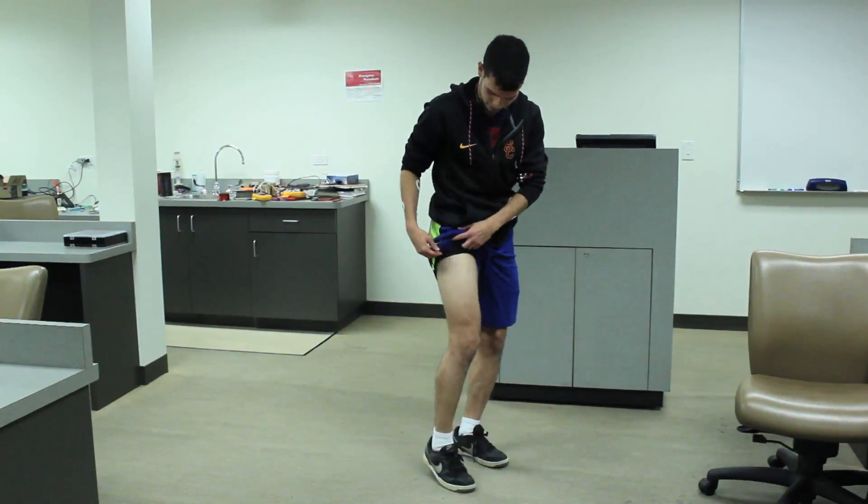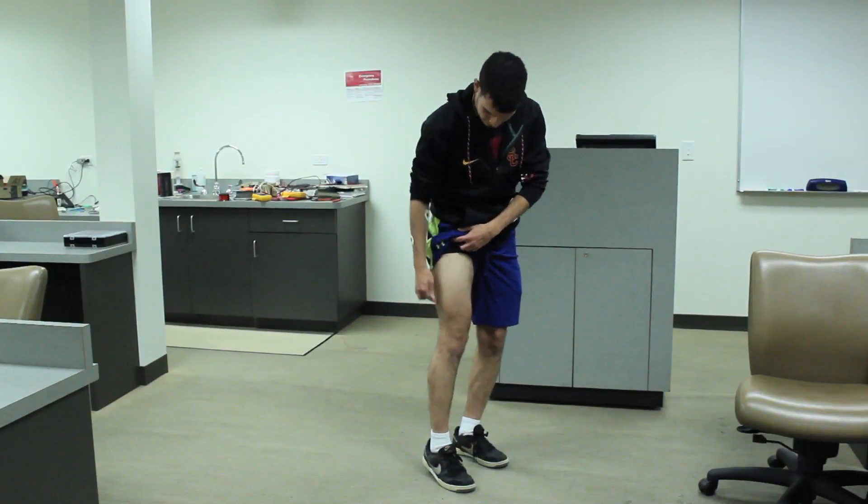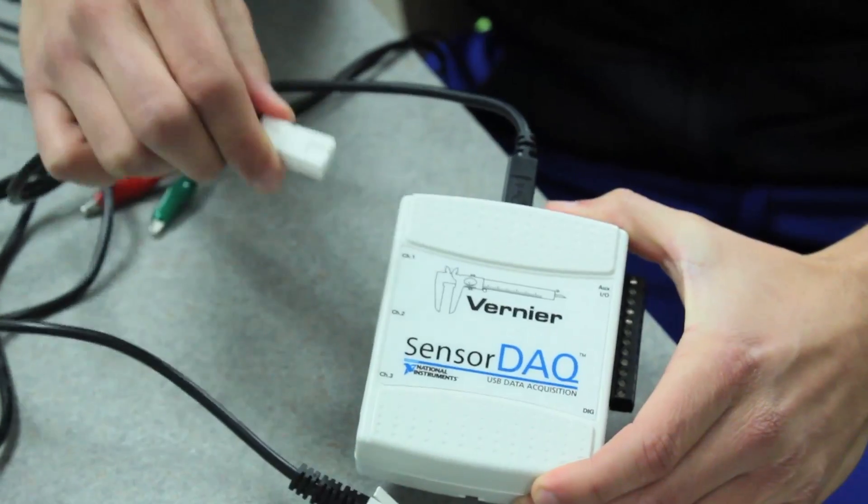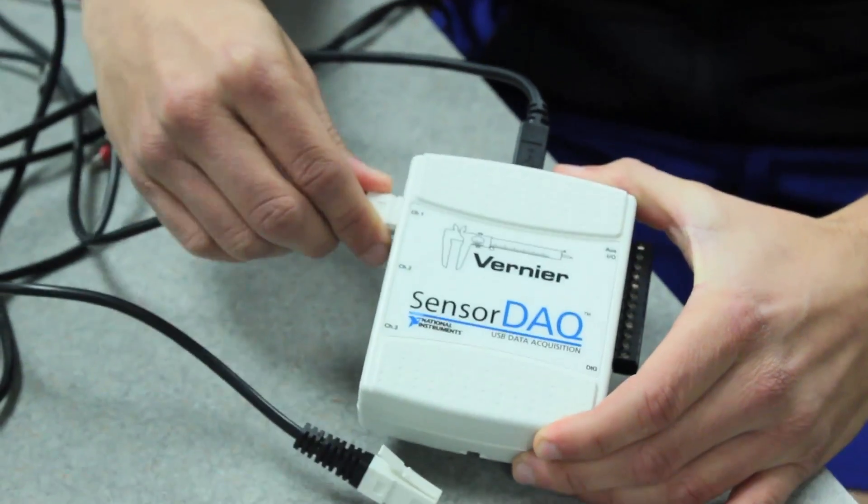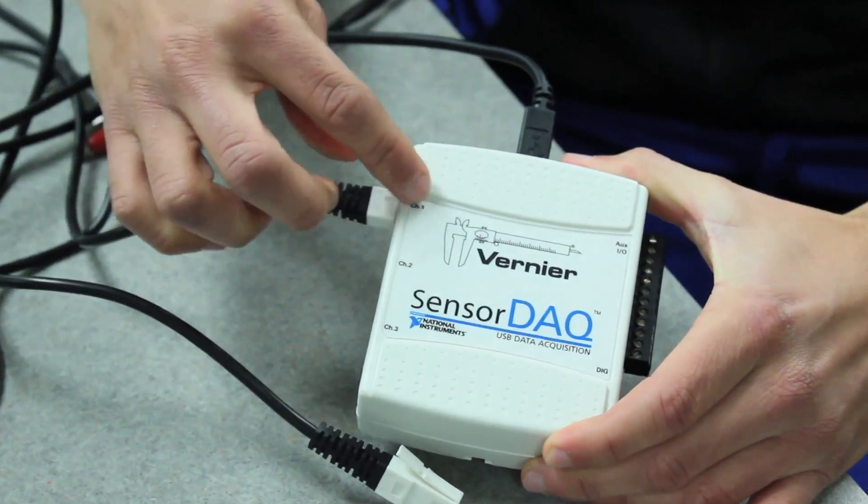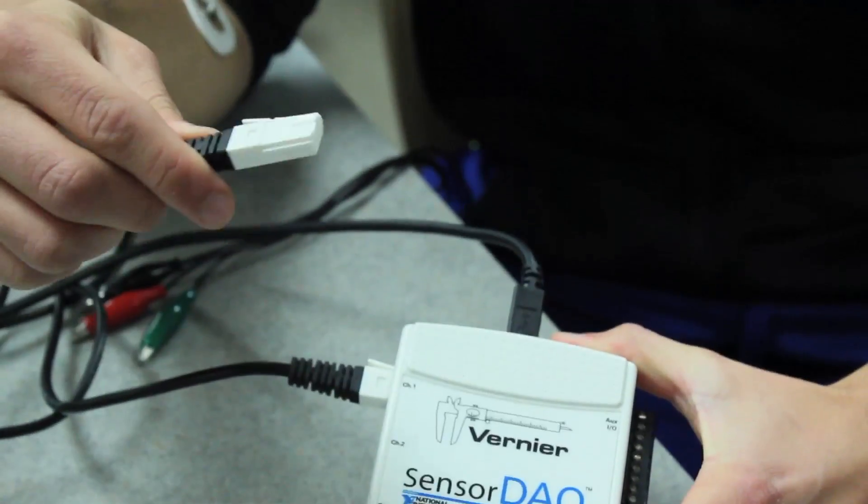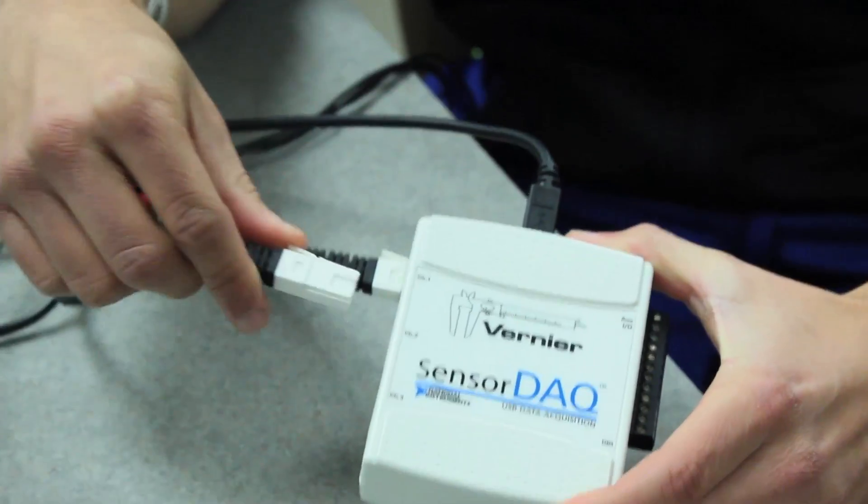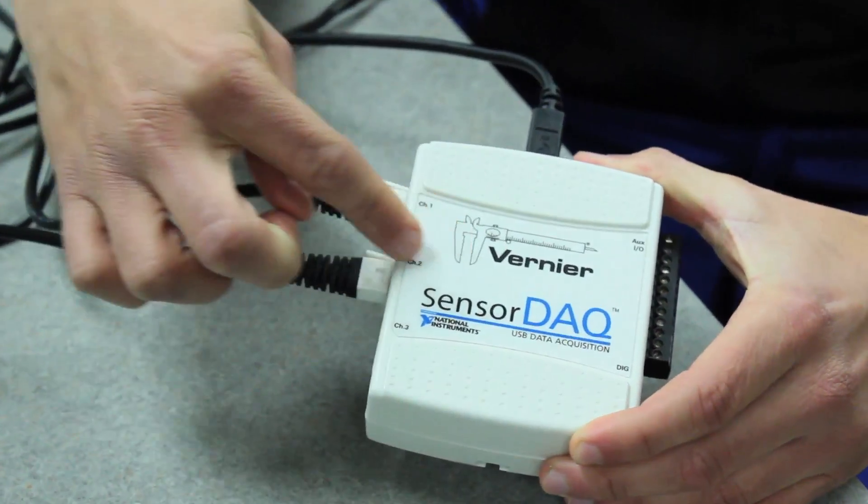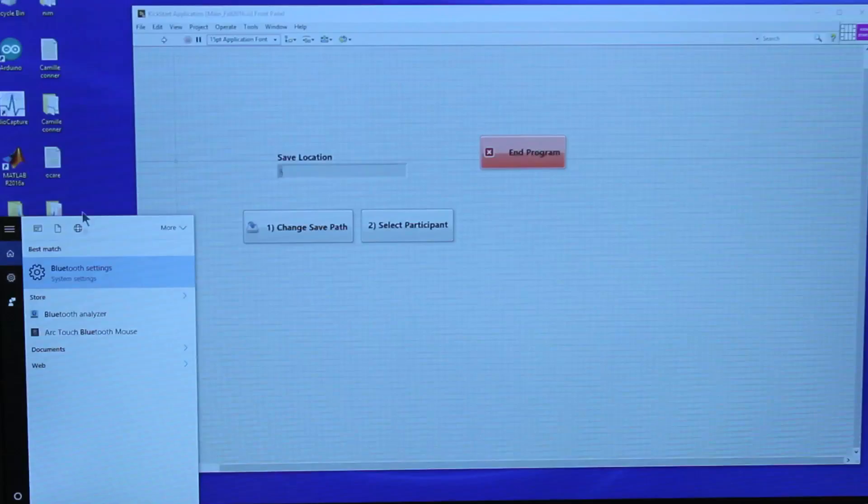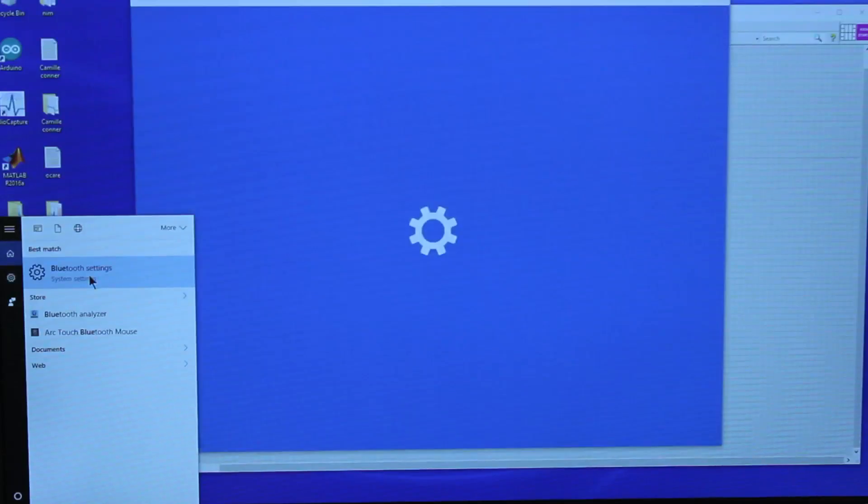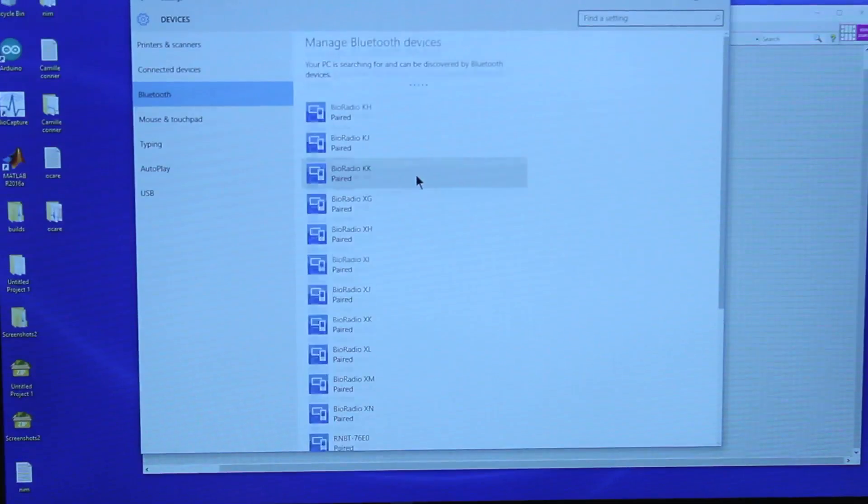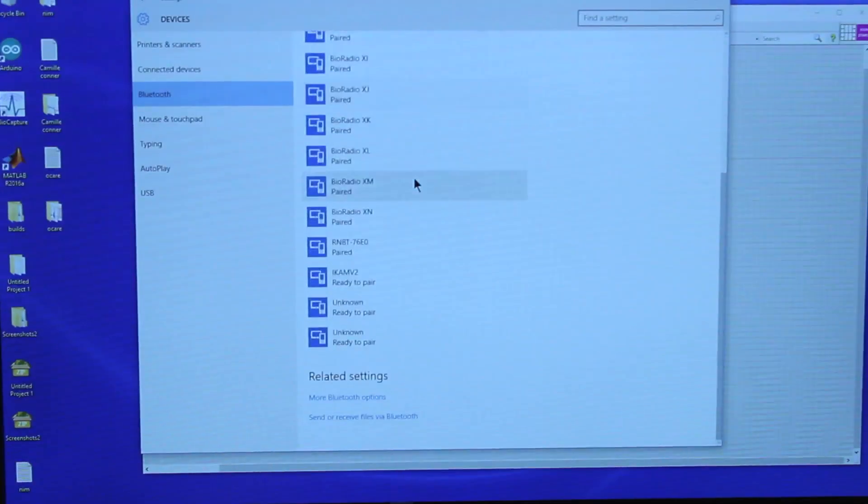The sensor from the tibialis anterior should be connected to channel 1, and the sensor from the quadriceps should be connected to channel 2. On the computer running the program, go to the Bluetooth settings and make sure the toy you intend to use is paired.